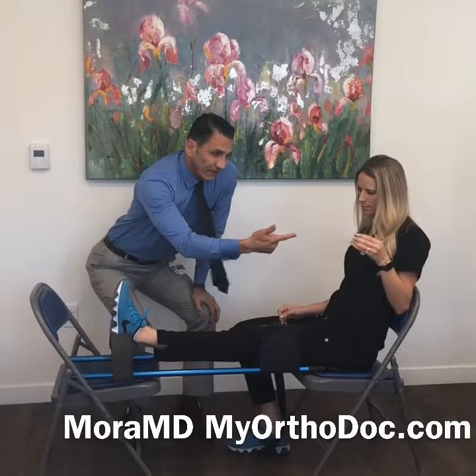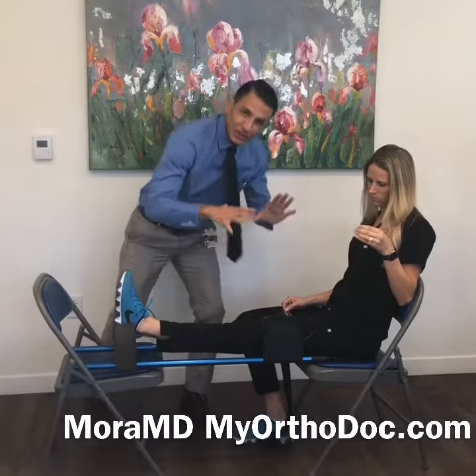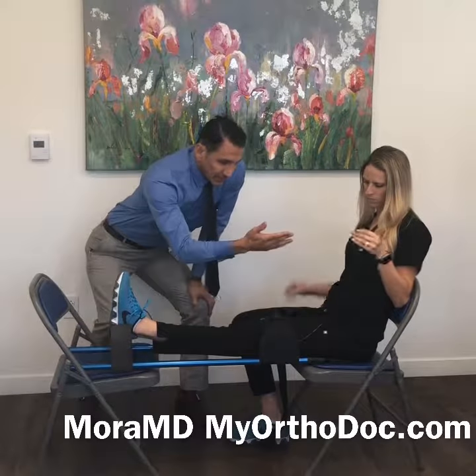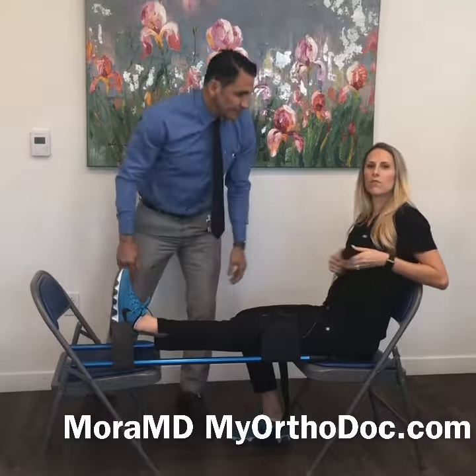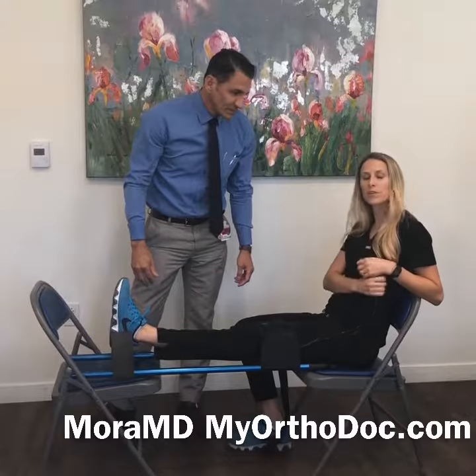So she's actually blowing up the cuff. She's blowing up the cuff, and this cuff goes around her thigh and it's actually pushing her knee down. So after it reaches a certain point, she'll stop. Kelly, why don't you tell us how long are you going to use this for? So you use this for a total of one hour a day — 20 minutes, three times a day — to help restore extension.